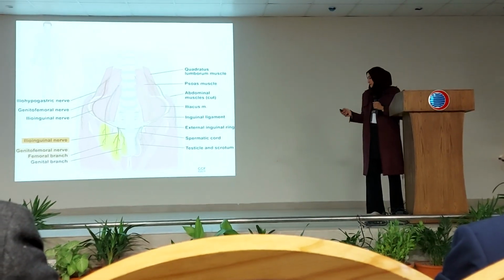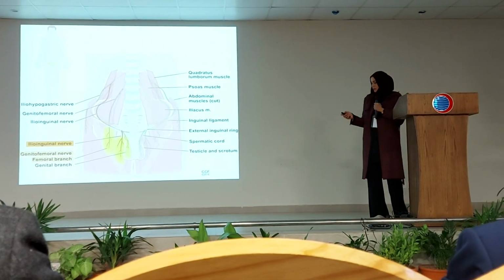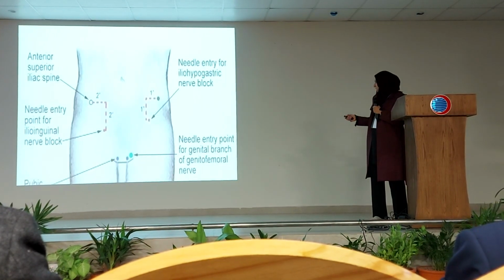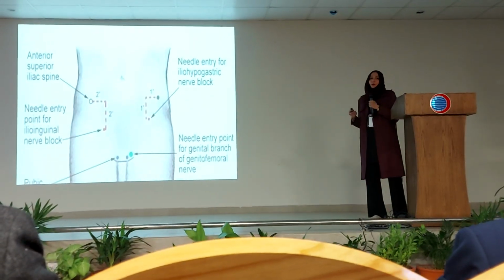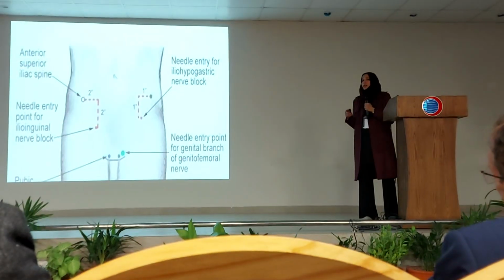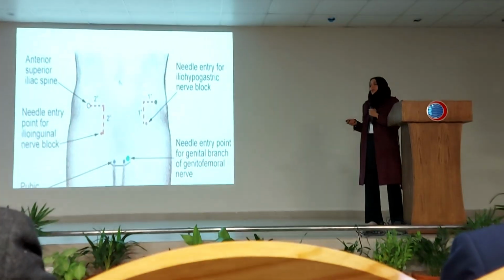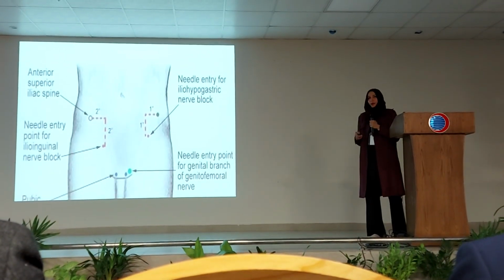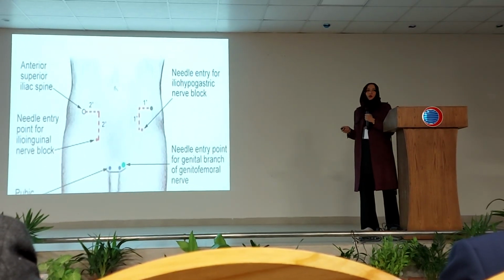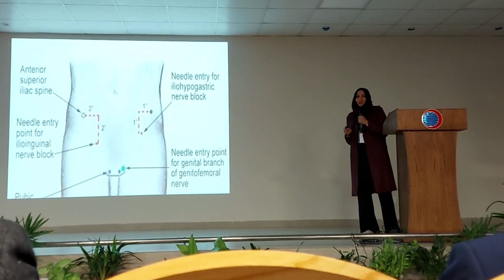We just ask the surgeon to block the genitofemoral nerve as well. How will they do this? First we perform the ilioinguinal iliohypogastric nerve block, and then when the surgeon is about to manipulate the spermatic cord, we ask him to inject a few mLs of local anesthetic in the spermatic cord, or at the root of the penis, which will block the genitofemoral nerve. And by doing that, we can perform the surgery, and of course, a little sedation won't do any harm.